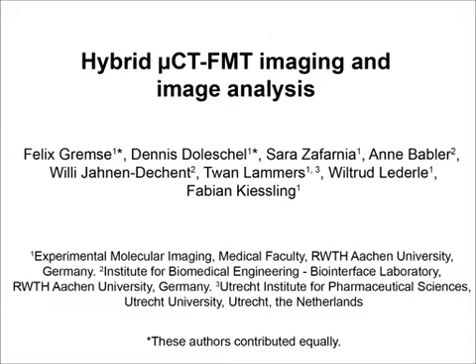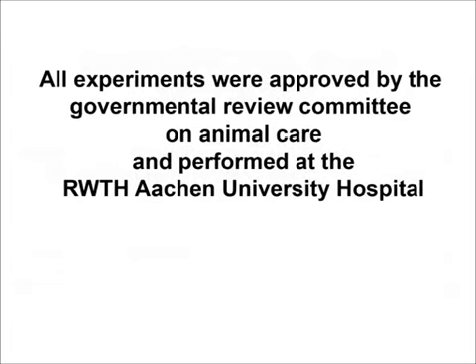Fluorescence-mediated tomography is a highly sensitive imaging technique to quantitatively assess the fluorescence distribution in anesthetized mice. Many targeted fluorescent probes are available, which allow imaging of angiogenesis, apoptosis, inflammation, and others. In this movie, we will show how hybrid imaging with FMT and µCT is performed at our institute in Aachen.